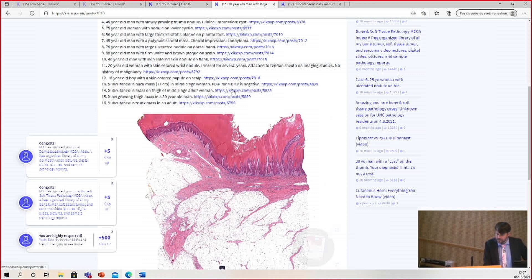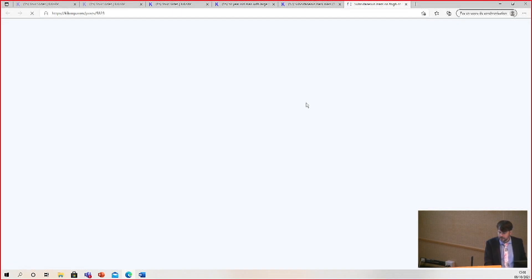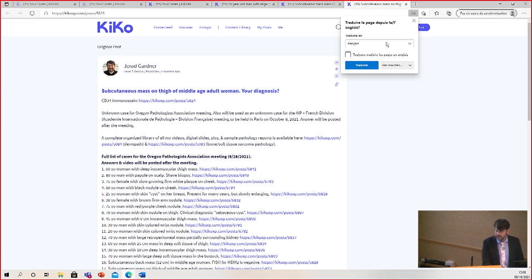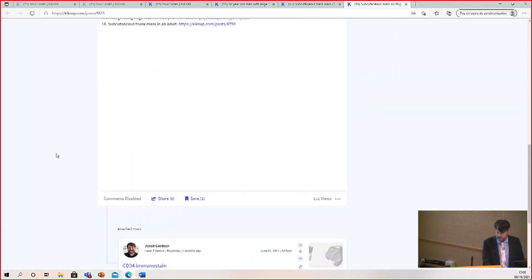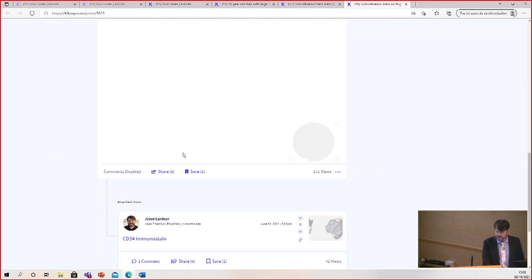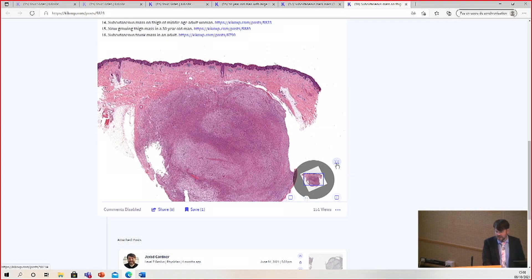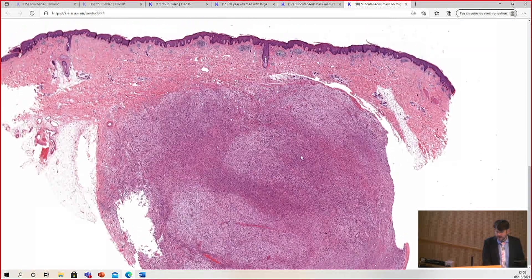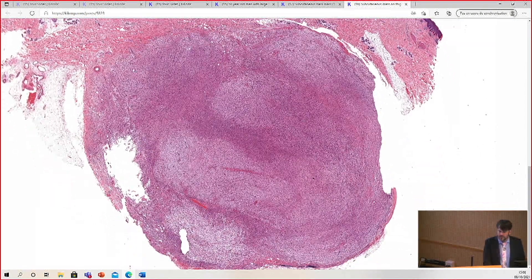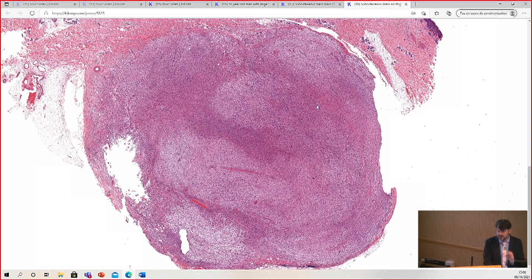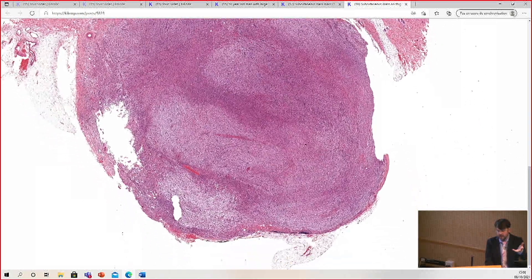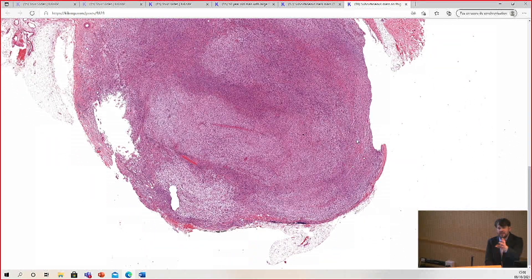The next case is a subcutaneous mass on the thigh of a middle-aged adult woman. This is a fun case, but one with a naming problem. You've got a nodule in the dermis pushing into the subcutaneous — relatively small. It looks like it's almost completely shelled out from the skin.